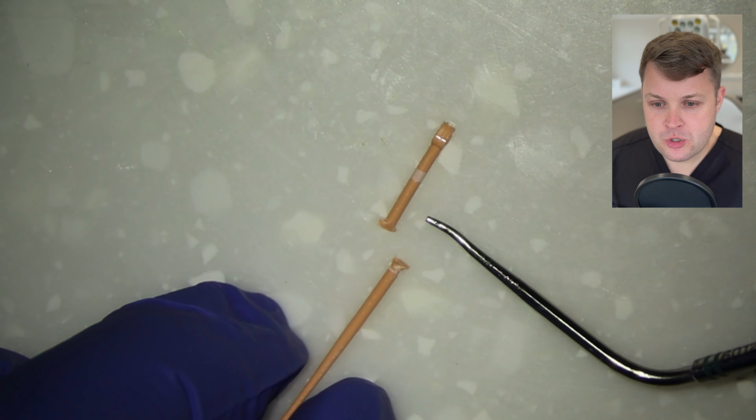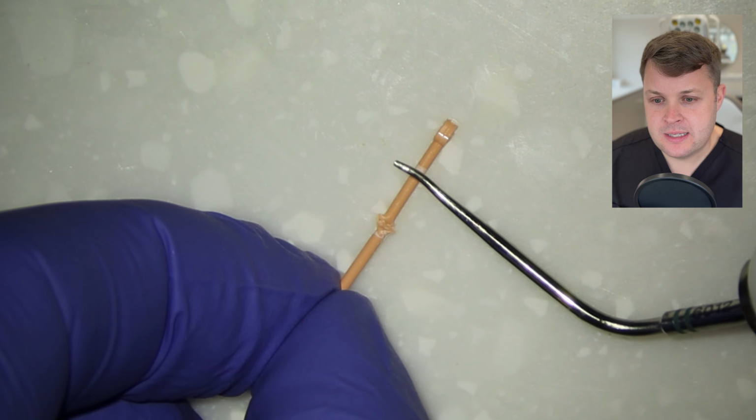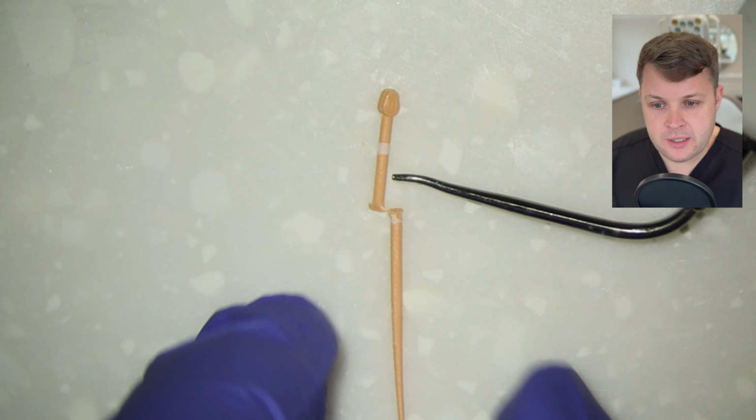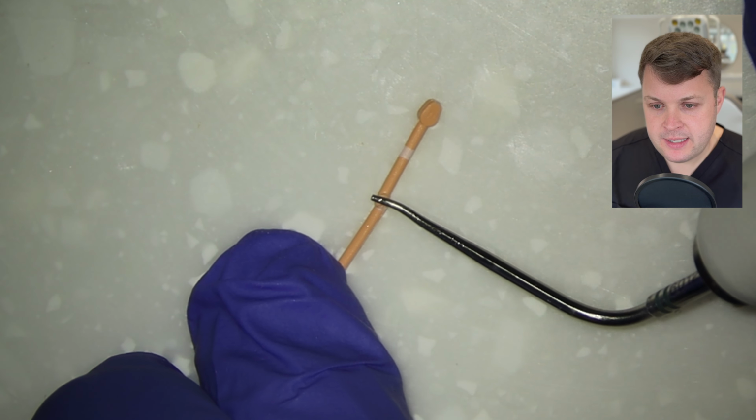But if you just tack heat the pieces, both the GP cones sort of mold into one. It is quite fiddly to get the 2 pieces together, but once you've tacked them together, what you'll notice is the join is just a little bit rough. So once you have gently melted these two pieces together, just tidy it up a little bit with the heated plugger.